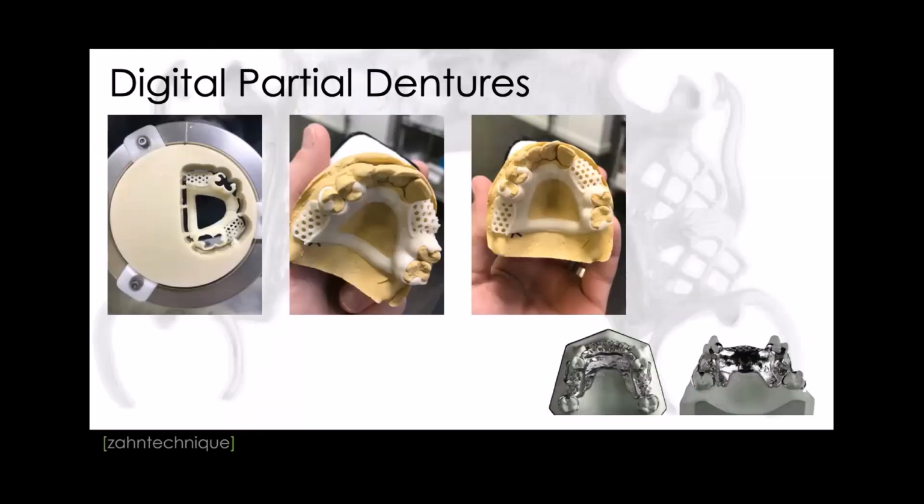So now if I look more into metal, my preference definitely is metal, right? If it's analog or digitally manufactured, it doesn't matter. From a partial perspective, the longevity of metal is definitely better. I think it looks better. It's more high end, more high quality. So if you go for a longer span, I will always go with the metal partial.